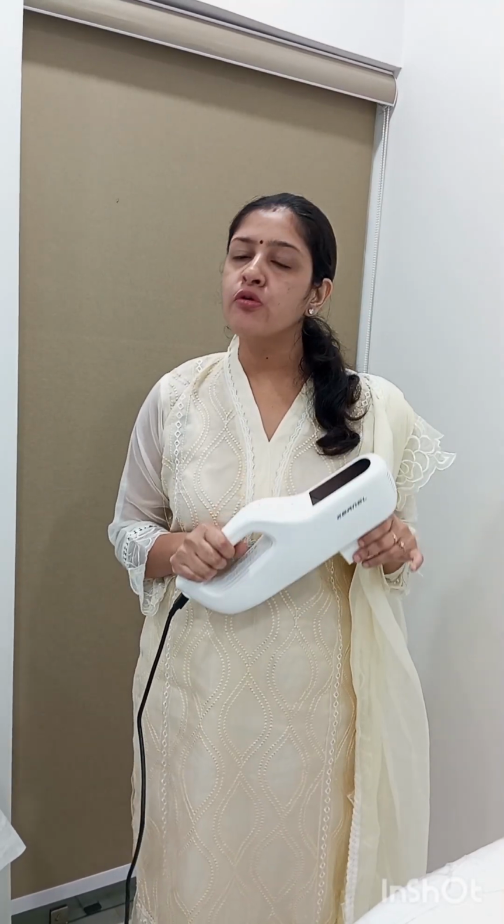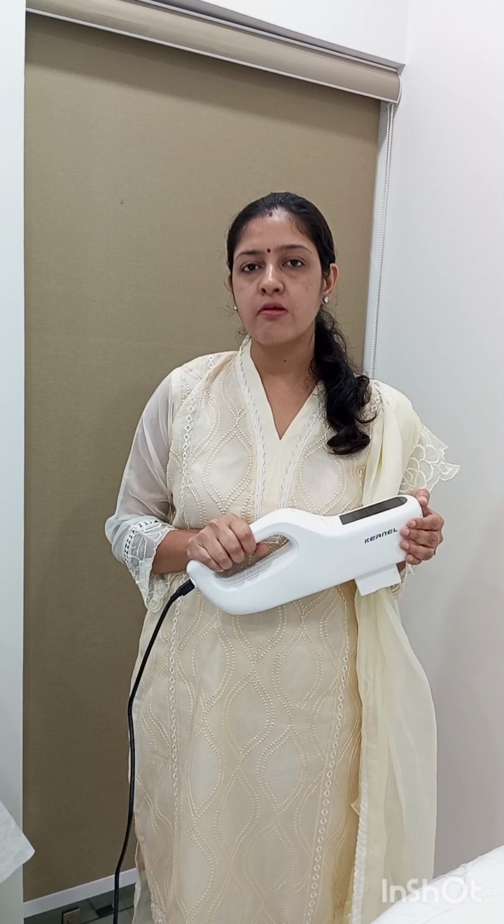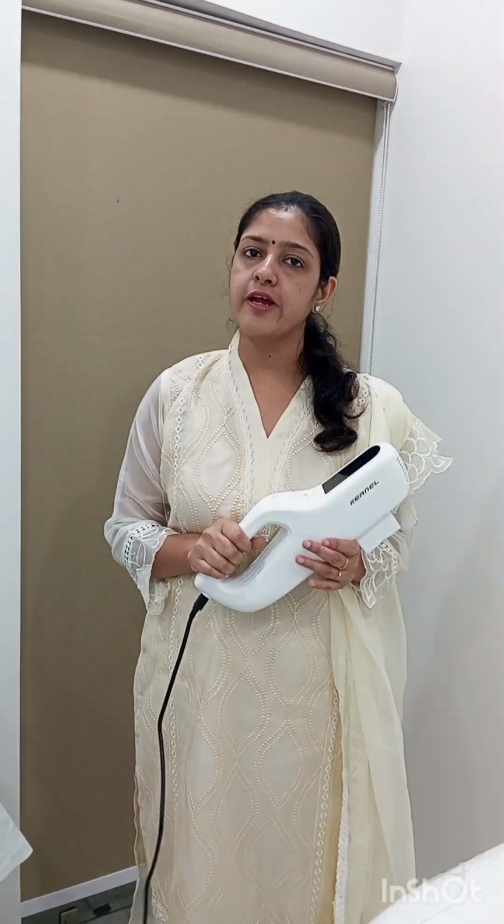Excimer emits a monochromatic radiation of 308 nanometer, and it is being used in the treatment of vitiligo, psoriasis, eczemas, alopecia areata, predominantly for the treatment of vitiligo and psoriasis. We have to first determine the minimal erythema dose of the patient before giving the Excimer light therapy. For example, the Indian skin type is usually type 4 or type 5. And the MED range usually varies from 150 millijoule per centimeter square till 400 millijoule per centimeter square.